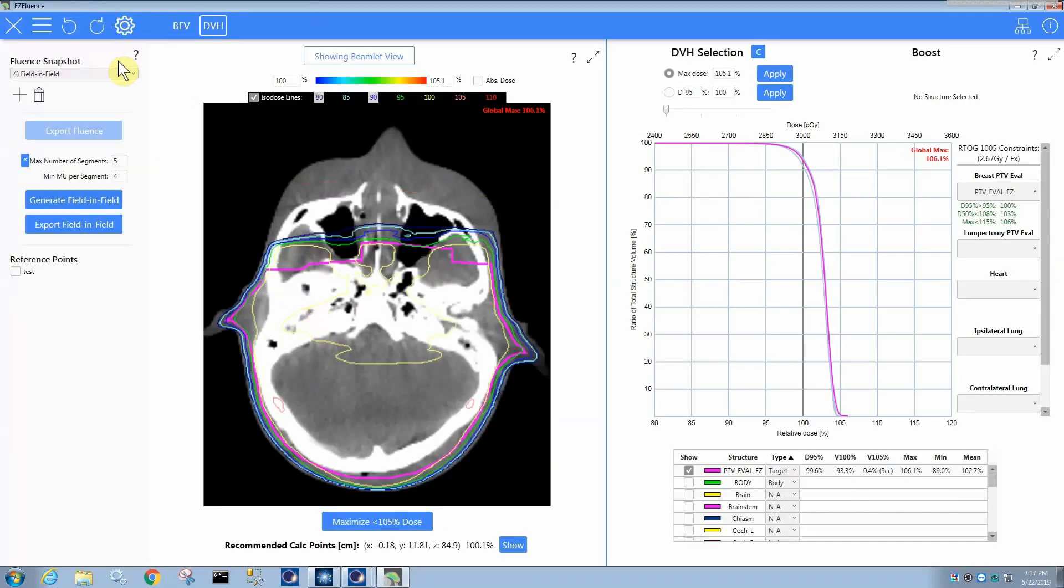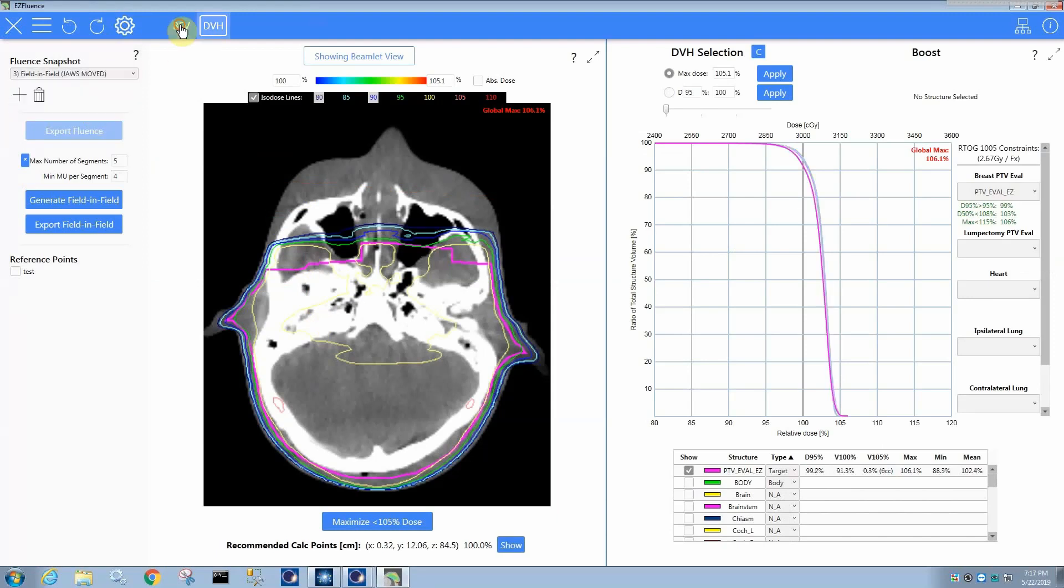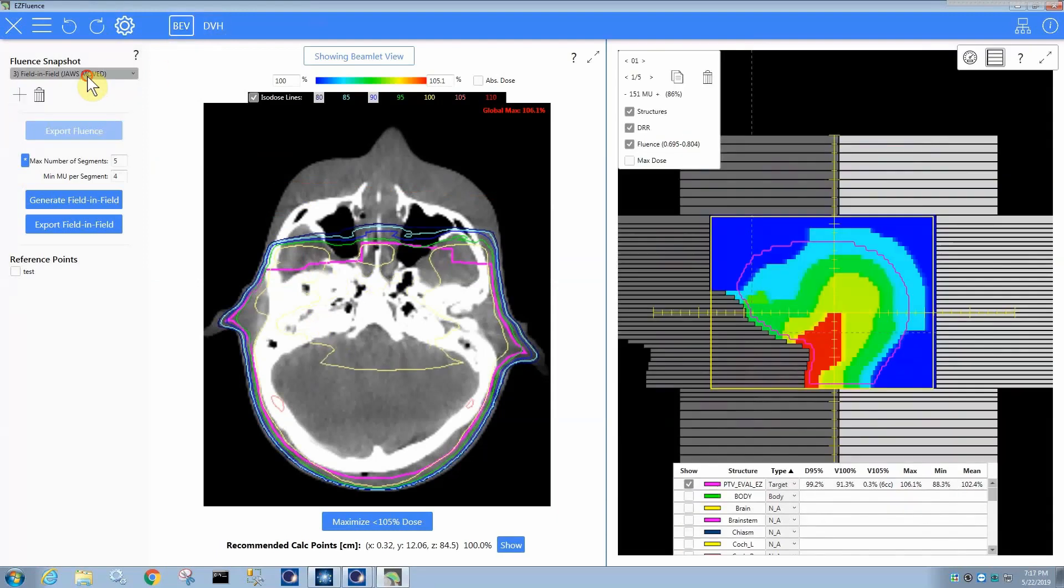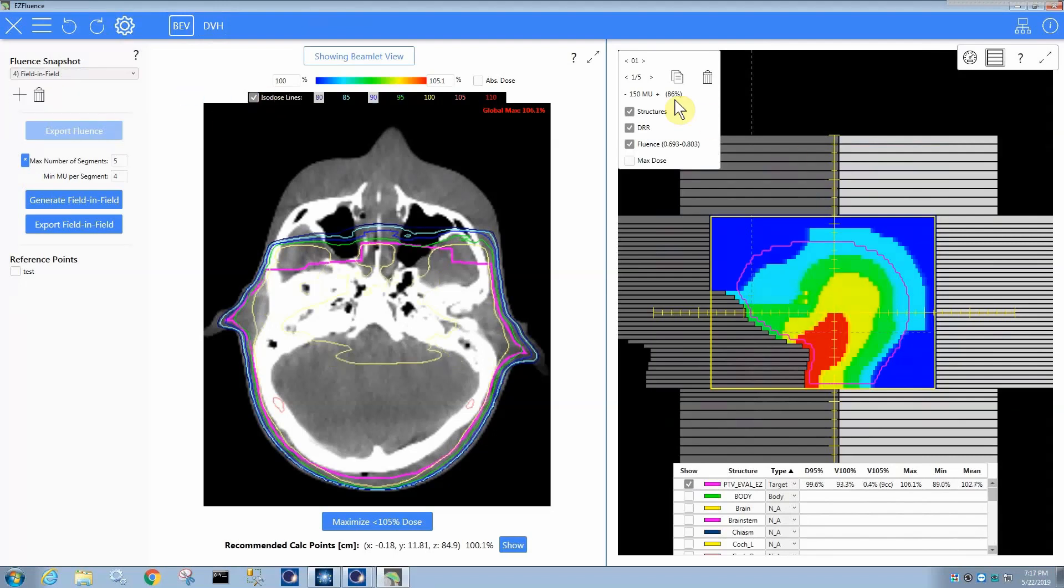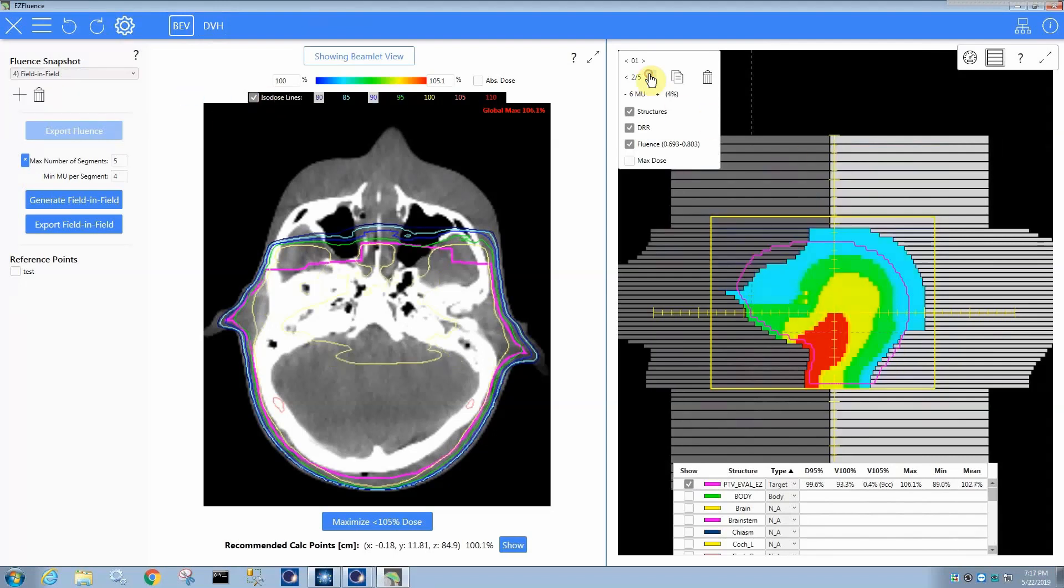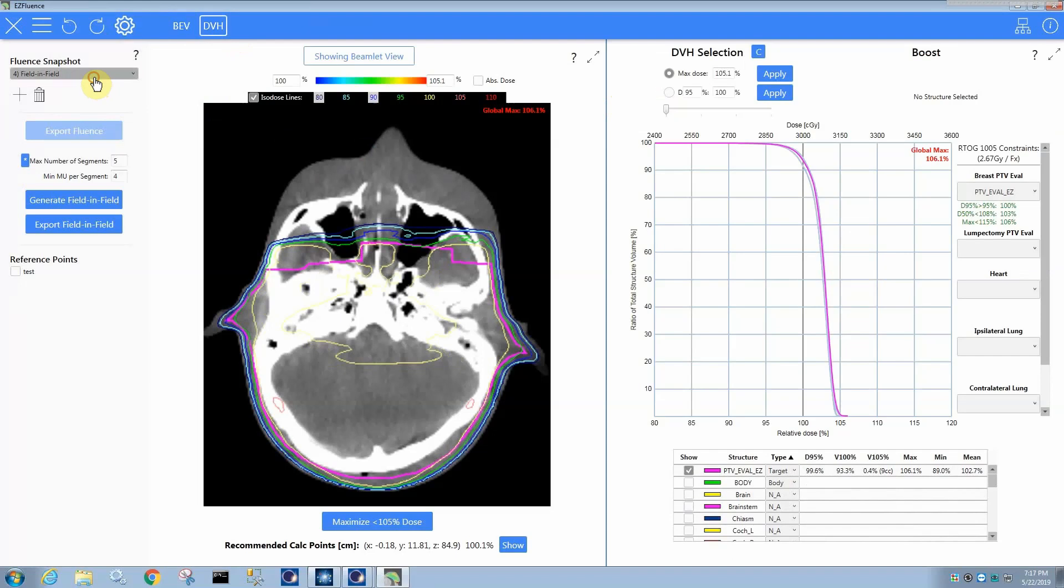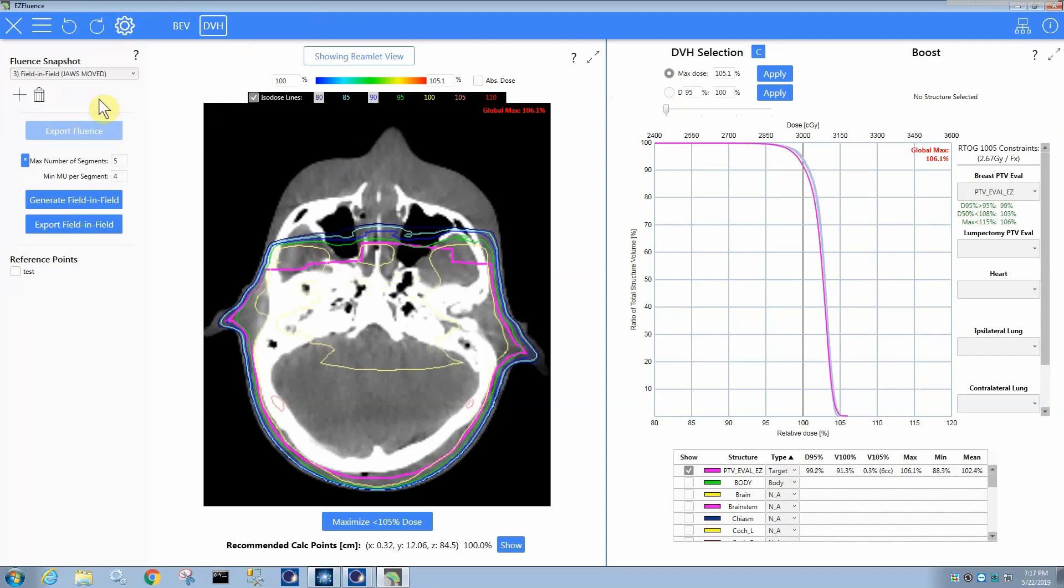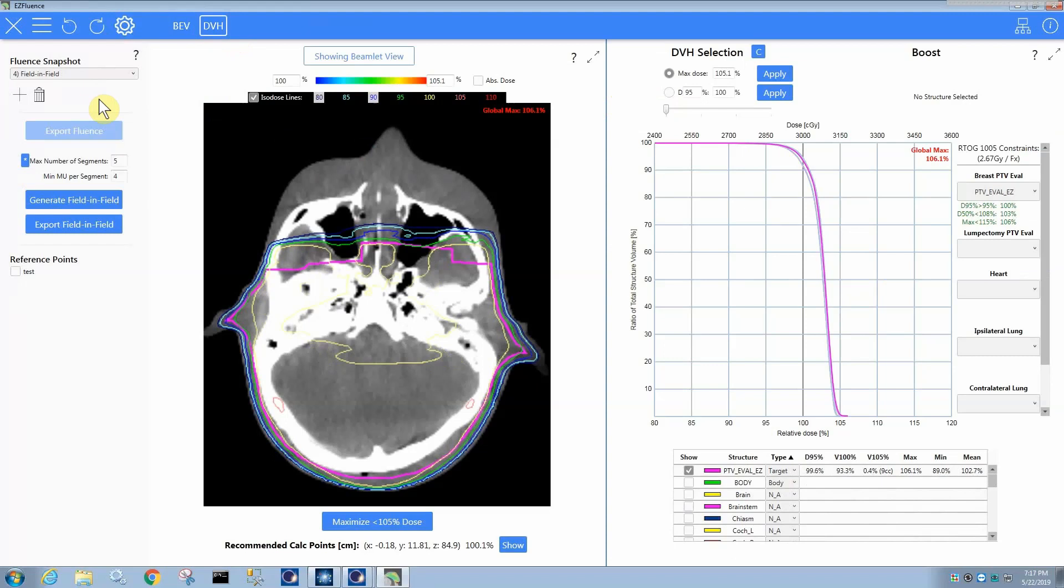So here we are, we have our field-in-field, and you can see it has a snapshot where the jaws were moved, so you can actually compare what happens when you move the jaws and what happens when you don't move the jaws. It does a slightly different dose distribution, but very similar in this case, so really there's no big benefit. But it is nice that it does both, and you can compare them because you can easily determine whether moving the jaws really has any dosimetric impact.